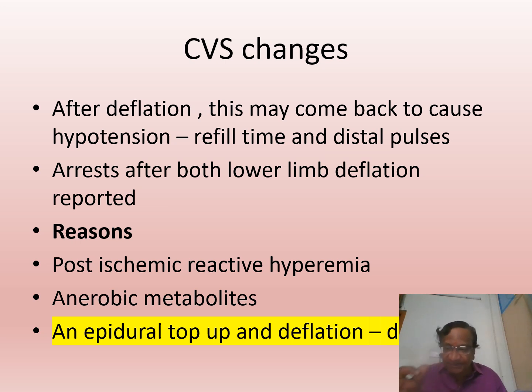Now you top up an epidural. The epidural top up is going to cause a BP fall in 10 minutes. And you also do a tourniquet deflation. This is a dangerous combination.